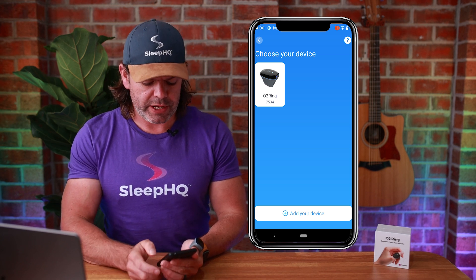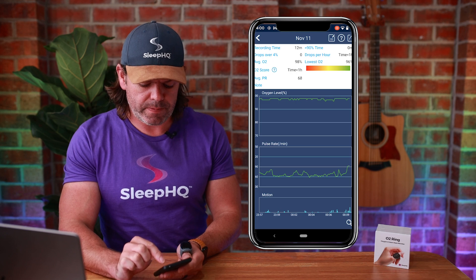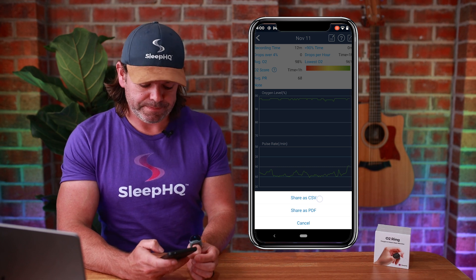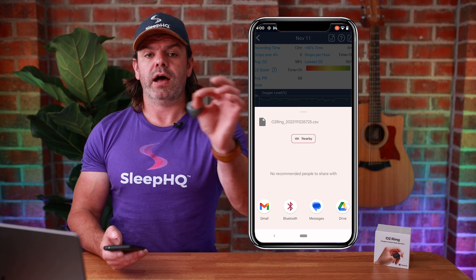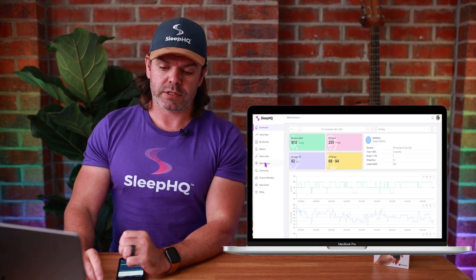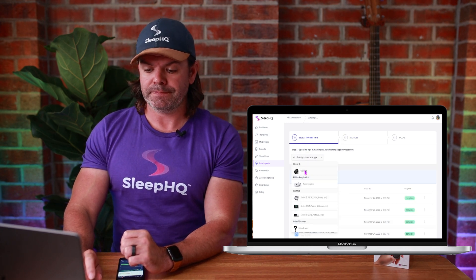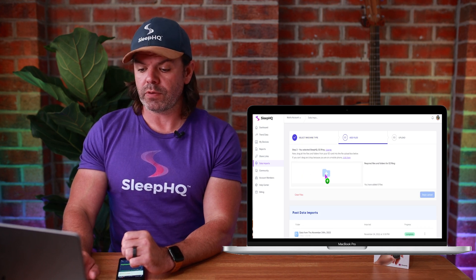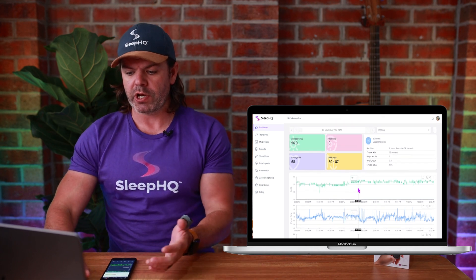Now let's look at the ViHealth Android app and do an export and upload to Sleep HQ. Here we are in the ViHealth Android app — click your ring, then to export, just choose one of the files, come up to the top right and click Share as CSV. You'll then need to share that file to your computer, iPad, or whatever you have, in order to drag that CSV file up to Sleep HQ. On your Sleep HQ profile, go to Data Imports on the left menu, make sure you select the correct machine type — O2 ring — then just drag and drop the file into the folder and click Begin Upload. Go to the dashboard, select the date, and there's the import done.